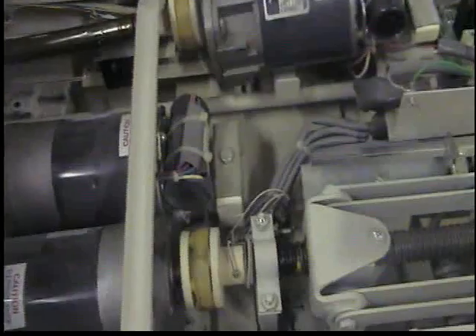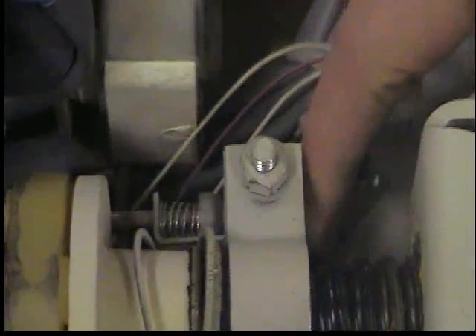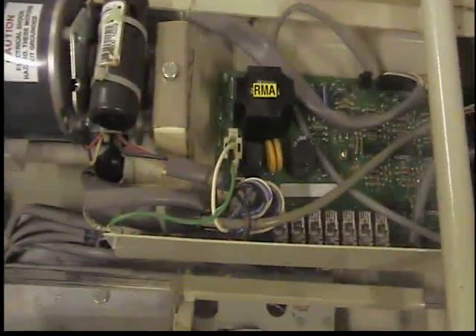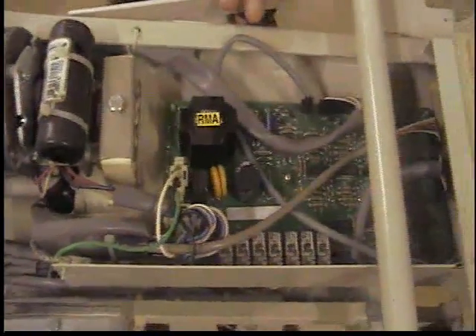The high and low limits — the high limit selector is right here. When this is engaged this way, it will stop. The low limit is all the way down here in the center; you can reach it from the bottom. When this hits the bed frame and pushes up, it will stop the motor. Make sure the brake spring is located right here, and make sure it is clean so that there is no debris or dust in it.